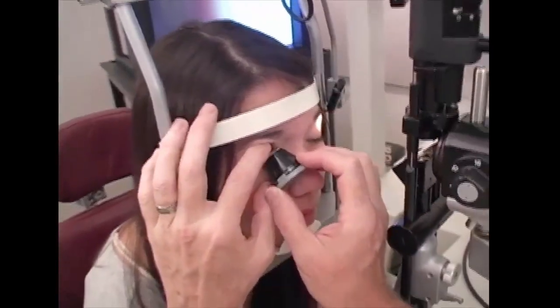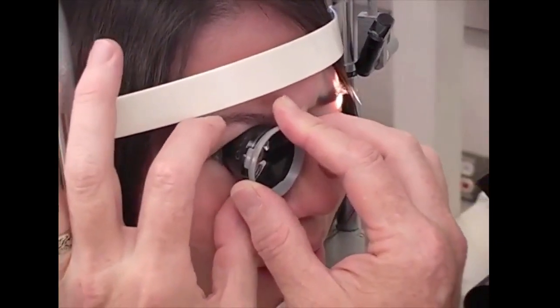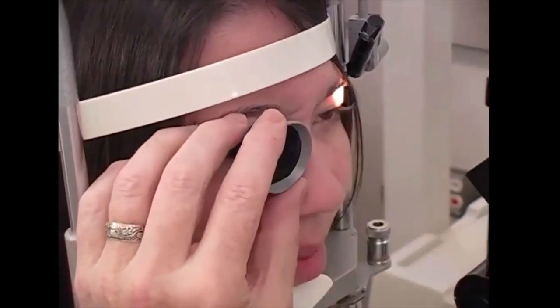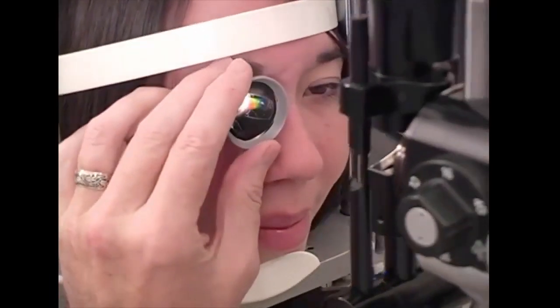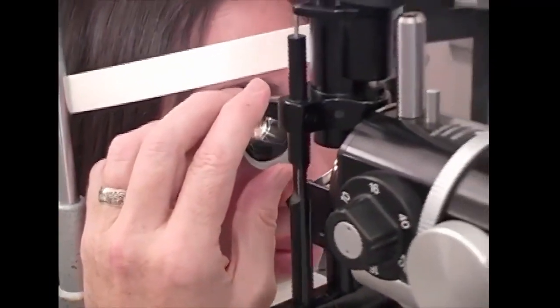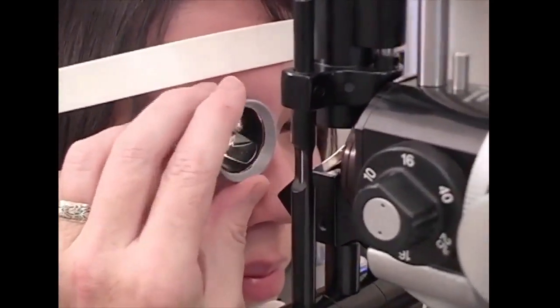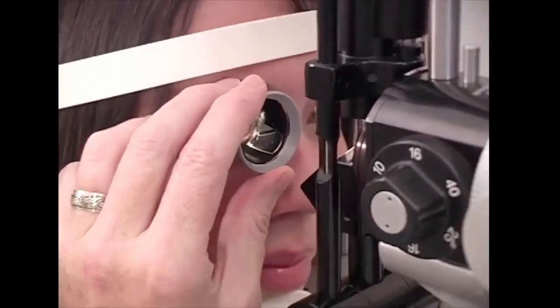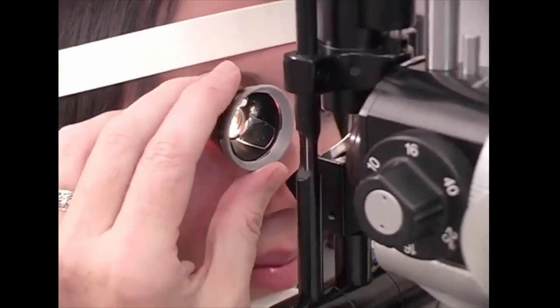Patient is anesthetized, of course. She looks up. I put the lens in and rotate the top back. And then I try to hold this lens with 3 fingers so that I can rotate it without using my other hand. My other hand is obviously on the joystick of the slit lamp. But this holding with 3 fingers takes a little bit of practice, so don't worry if that's not easy to do at the beginning.